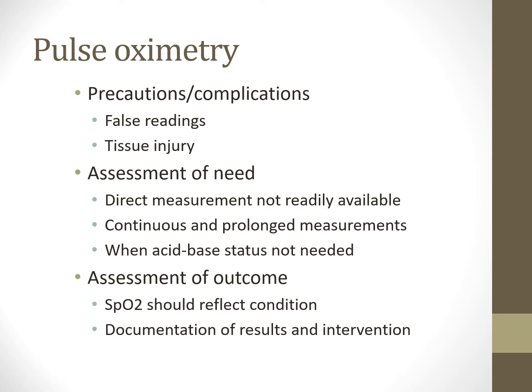There could be motion artifact. So this is something where if it looks weird, look at your patient first. Does this match their clinical condition, right? There's no need to call a code because the monitor reads one thing, but the patient's actually talking and speaking fine, right?